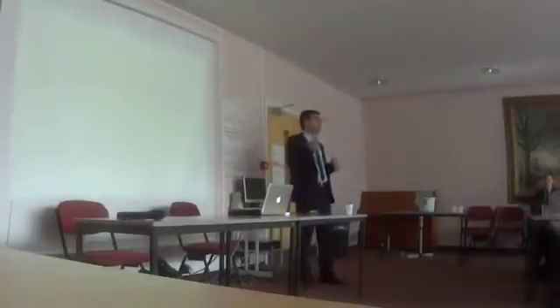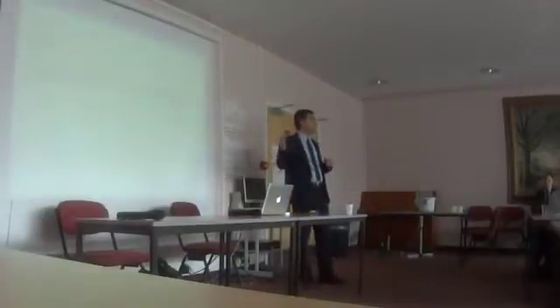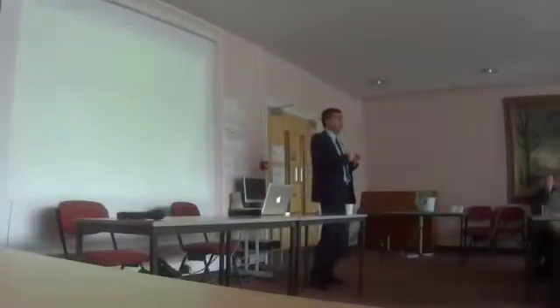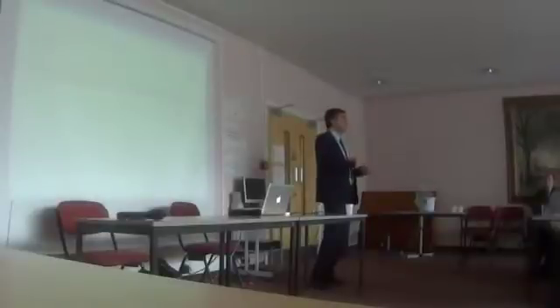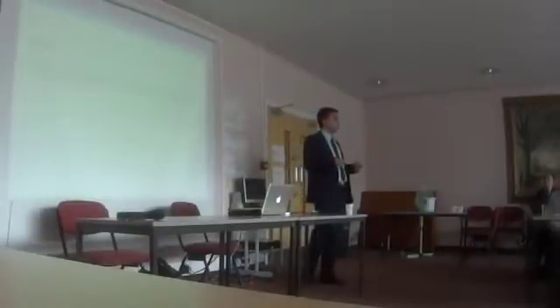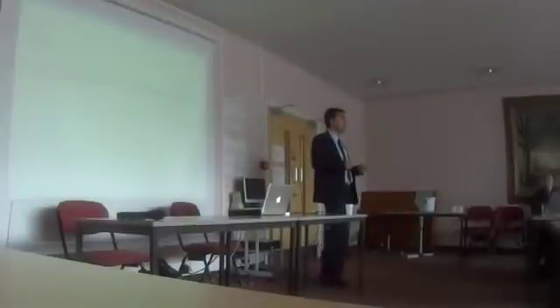So if the patient had a TOE, and these are high-risk patients already, with that CHA2DS2-VASc score, which is the patient with heart failure, previous TIA or stroke, age more than 75, diabetes, hypertension, so we already know that these patients should be on warfarin and anticoagulation one way or another. So if we do the TOE, would there be any other information helping us? Which patient would benefit from anticoagulation or maybe aggressive anticoagulation compared to the others?